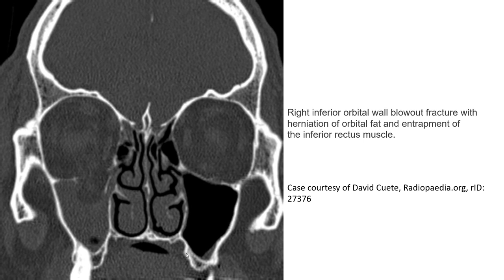Let's see this first case of orbital fracture. In the skull CT, or head CT, in bone window, what we can see here is the right inferior orbital wall blowout fracture with herniation of orbital fat and entrapment of the inferior rectus muscle, as you can see here in the image.